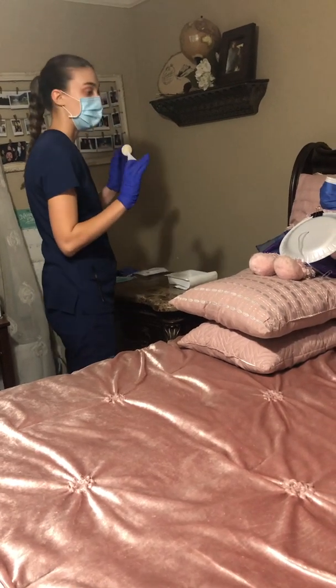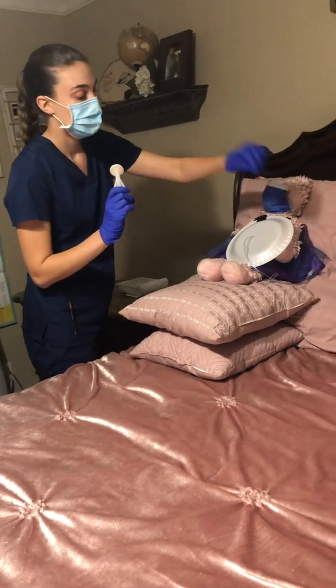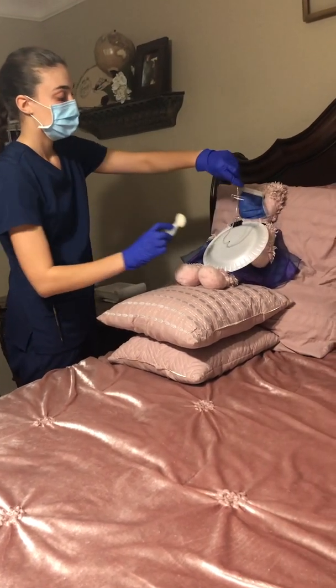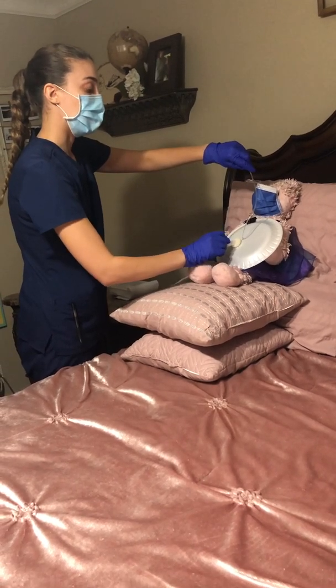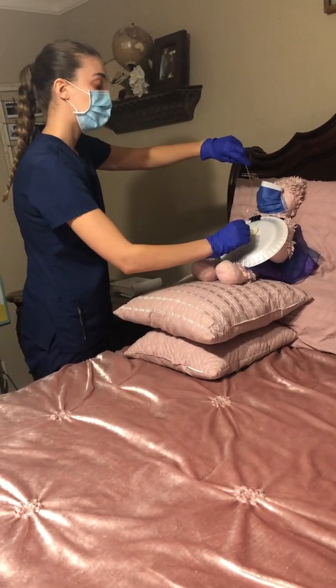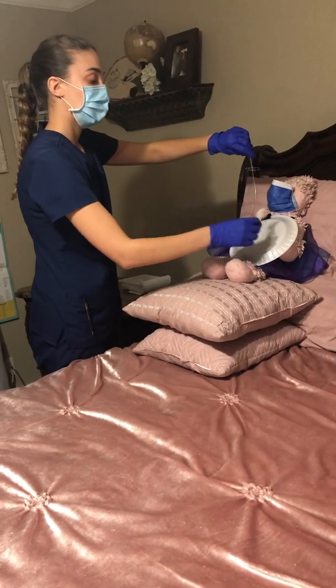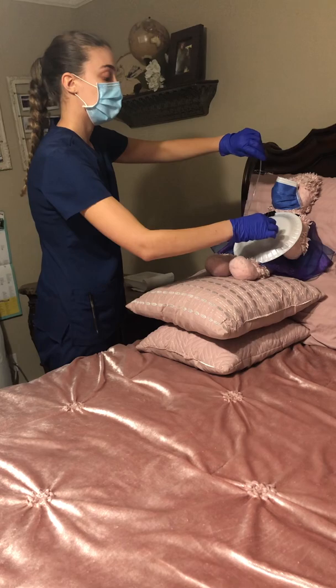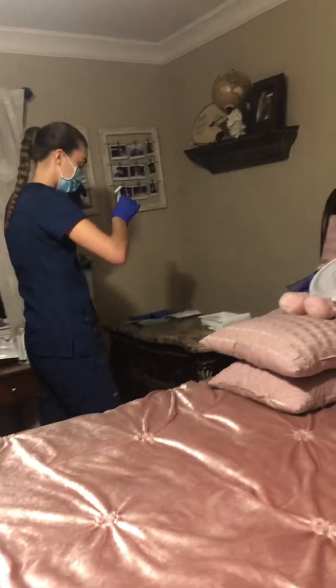Alright, Mrs. Jones, I'm going to ask that you continue to keep your head turned to the side. Use my left hand and grab the tube. And I'm going to go in a 2-inch window right around the site for the hospital policy. Make sure that I clean up the tubing. I'm going to let that dry for 30 to 60 seconds. I'm going to keep my hands sterile and discard that.